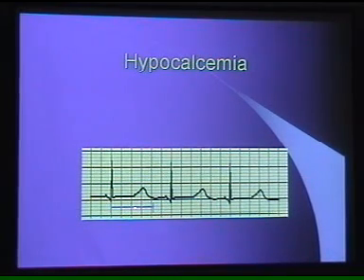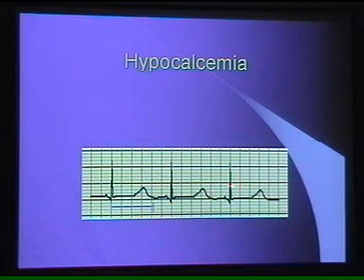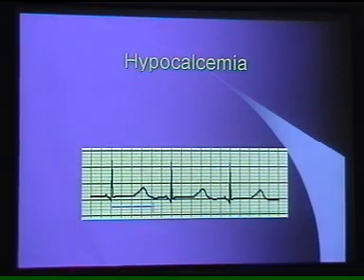Similarly, a very short QT interval can also be a congenital abnormality, or it can develop as a result of hypercalcemia, like in a person with hyperparathyroidism or malignancy or any other metabolic disorders. Next one.